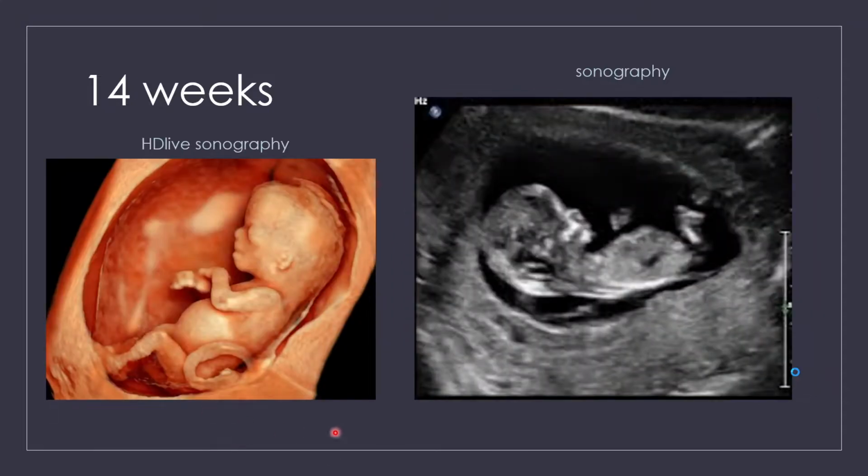By 14 weeks. Now these are both ultrasound pictures, but this is an HD live image. So it's got the light aspect added to that 3D imaging. So your facilities probably do not have something as advanced as this, but you may be lucky and have something. You may be able to get some of these really cutesy pics. But we can see really easily all the different external structures. And then using the 2D ultrasound, right here, that's the maxilla. There's the chin, there's the nose, the frontal bone. This right here is the stomach.